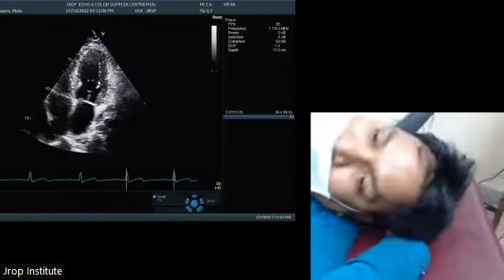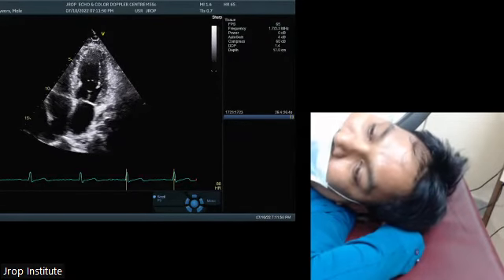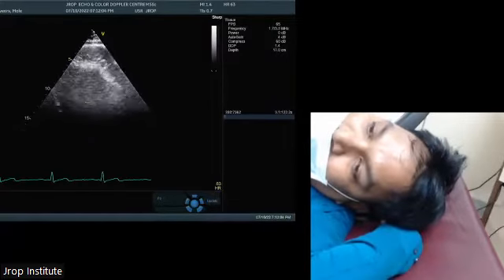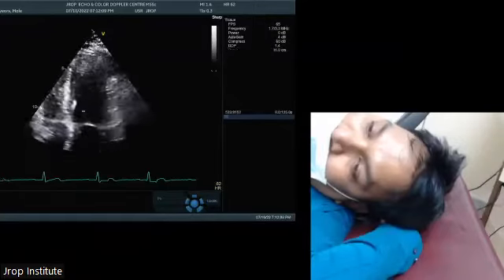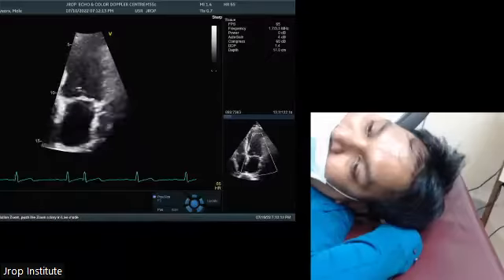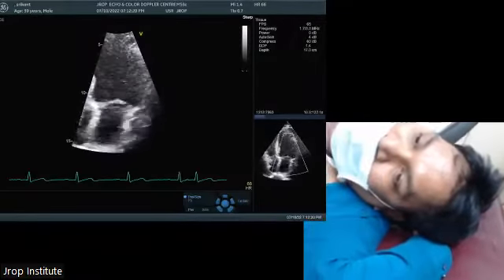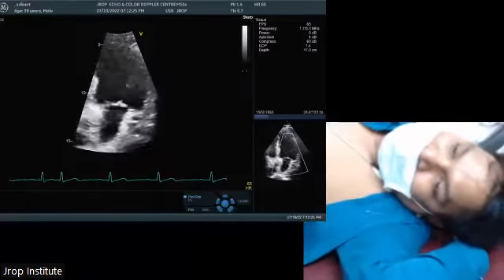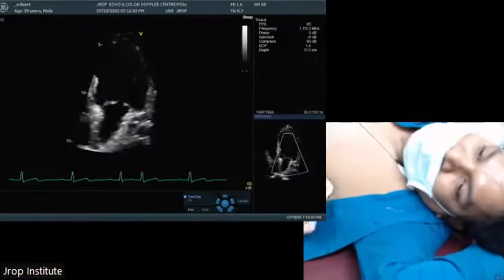Okay, sir. Dr. Venkatesh, how are depth and zoom different, sir? Zoom does the same thing also. How are depth and zoom different? Okay. Please raise your hand because other people are in the line also. So this is depth, which I was talking about, correct? This is a button with depth. There is another button which is known as zoom. Now this is zooming of a mitral valve. We need zooming for looking at vegetations. These are not vegetations. These are chords which are seen in the patient. Correct?